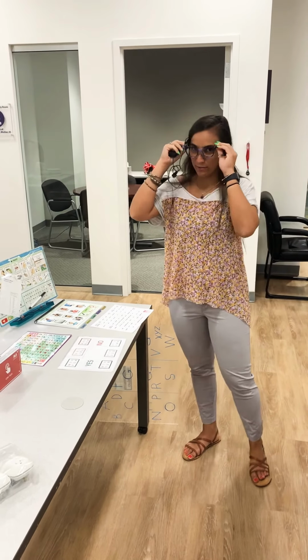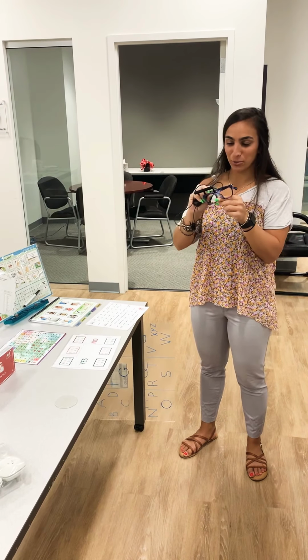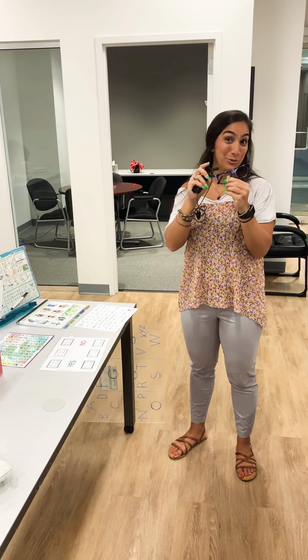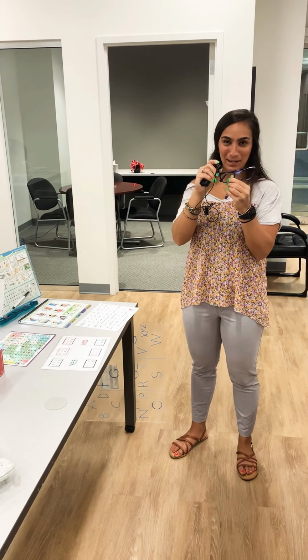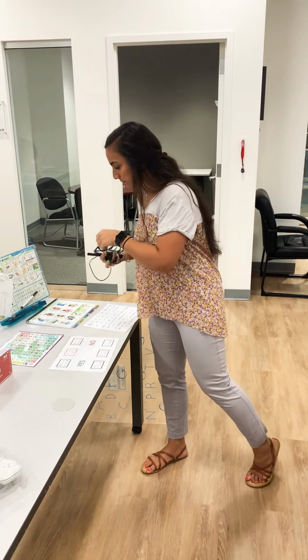A very low-tech, or DIY, way of creating something like this is just going to the dollar store, buying a pair of glasses, popping out the lenses, and getting a cat laser toy, and taping it on the end, and then you have yourself a head-mounted laser.